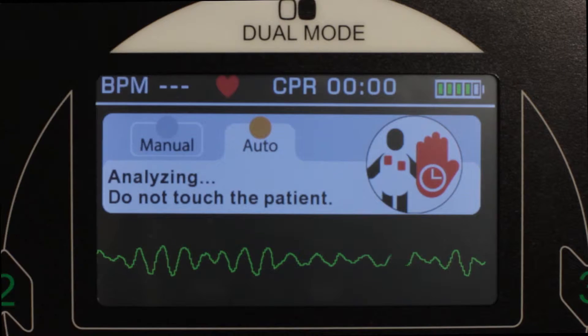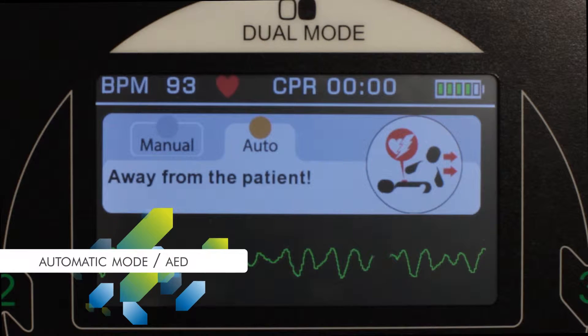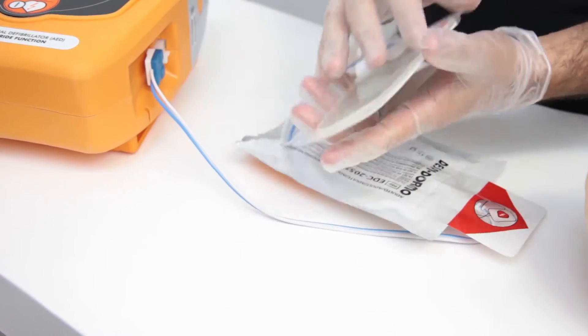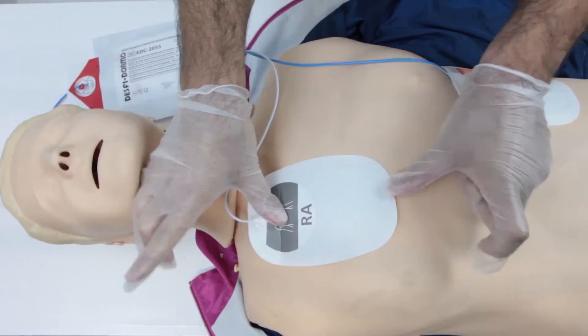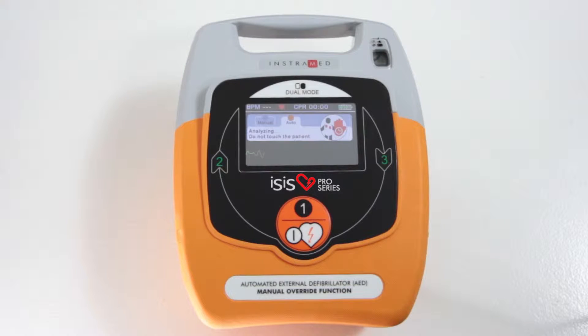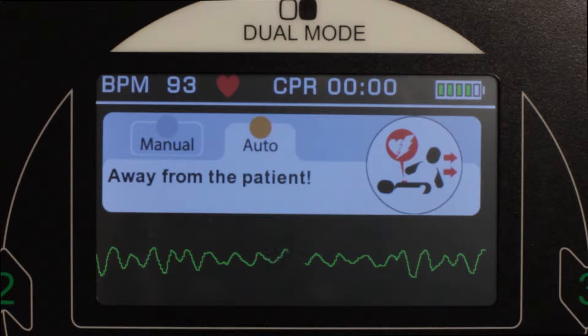In automatic mode, the eSys acts as a standard automated external defibrillator which can be used by a single person who has had basic training. Simply position the adhesive pads on the patient and press the only button there is to begin treatment. The eSys will use an EKG to assess the patient's condition of cardiac arrest, consider the clinical variables, and automatically apply the appropriate shock.